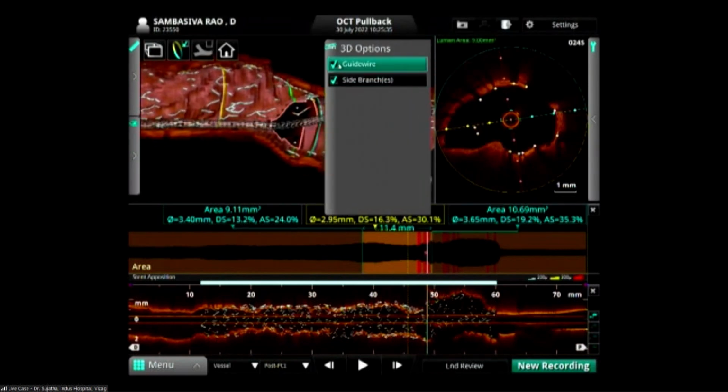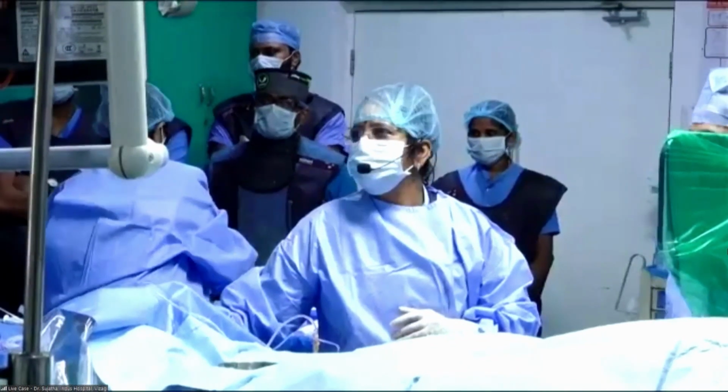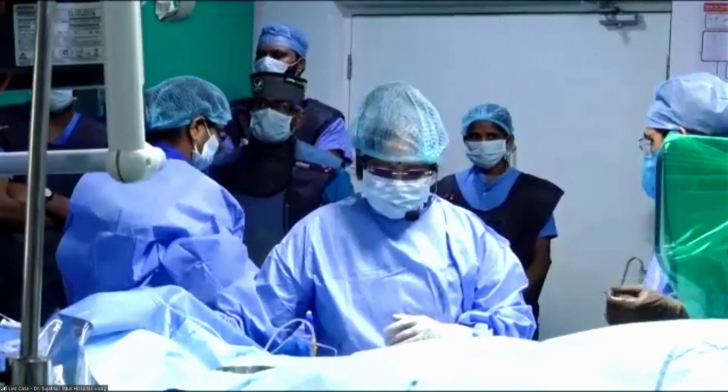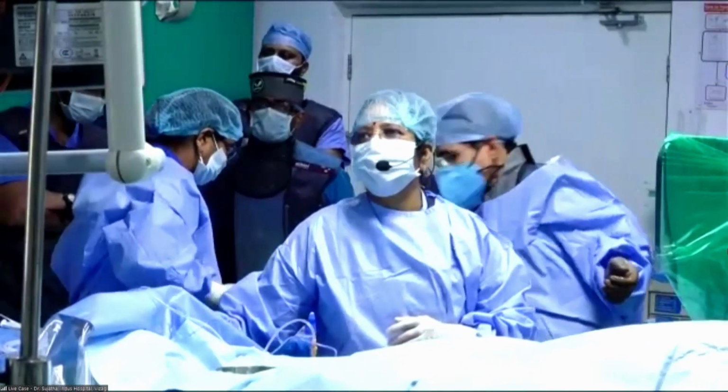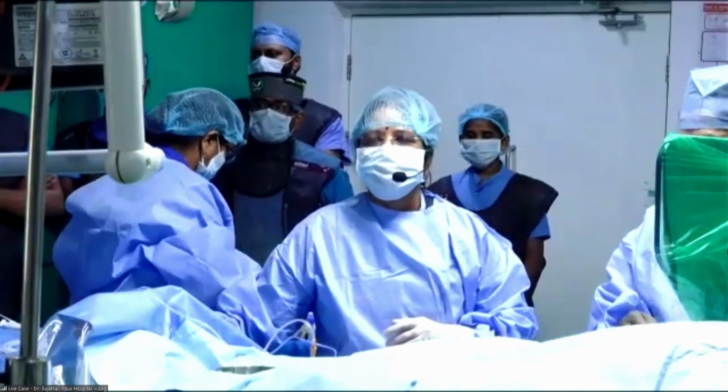Thank you, madam. Congratulations. I think that's fantastic. We can go and look at the distal circumflex if you want, with the direct stent later on, or in this setting, madam. It looks like a straightforward short lesion. You can address that. Perfect job. Excellent. Thank you very much for your demonstration.